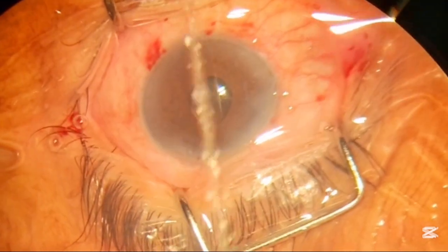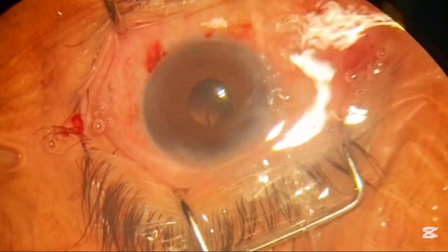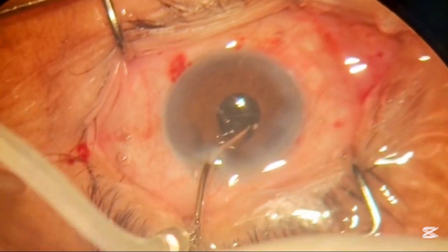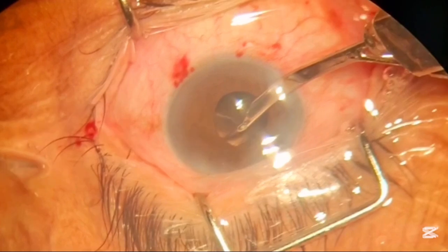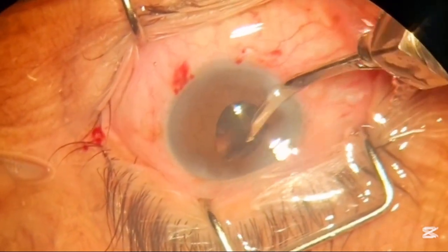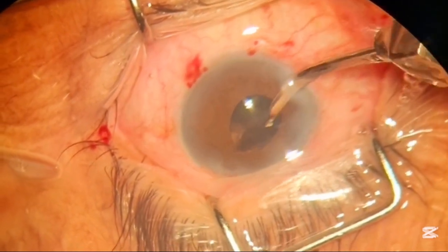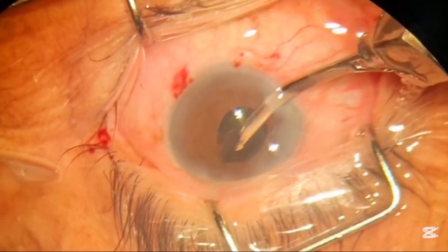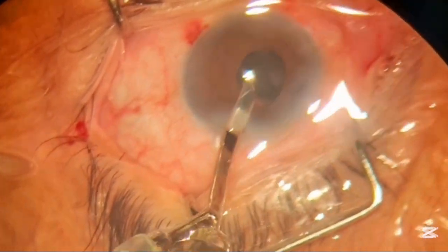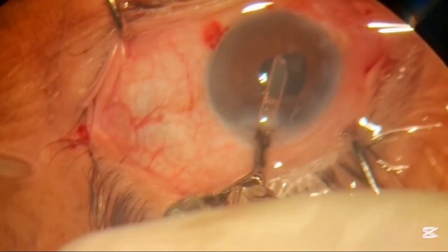During surgery, whenever there is variation in intraocular pressure, the pupil can return to its undilated position. After removing all the lens matter from behind the iris, we felt that the intraocular pressure started rising, so we removed the lens matter quickly.